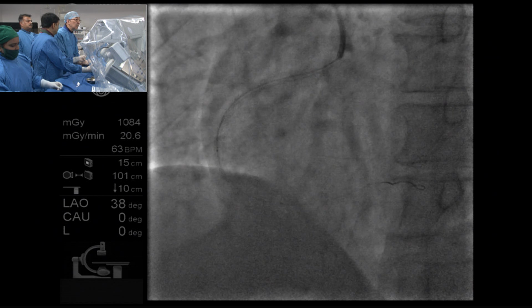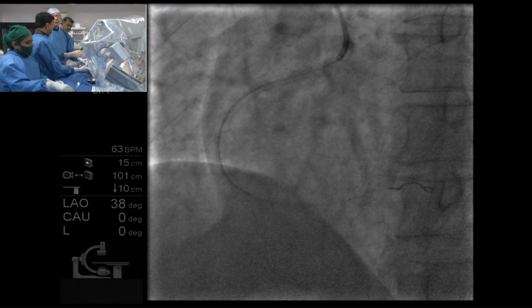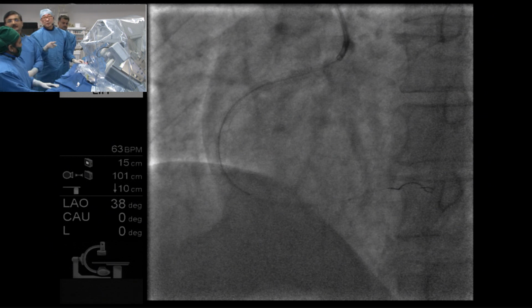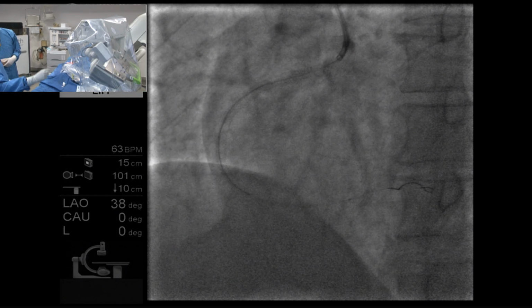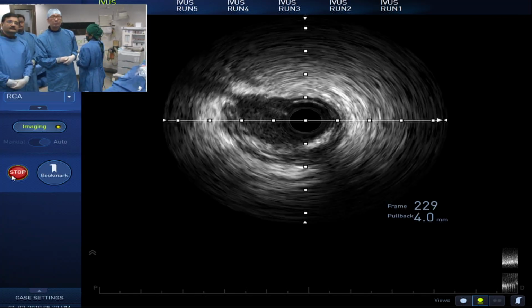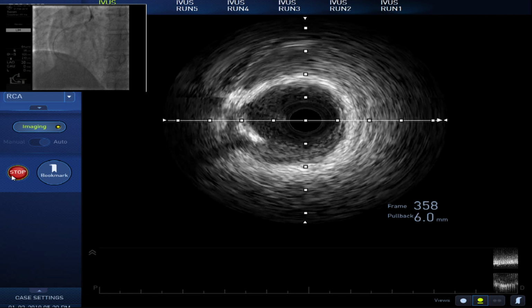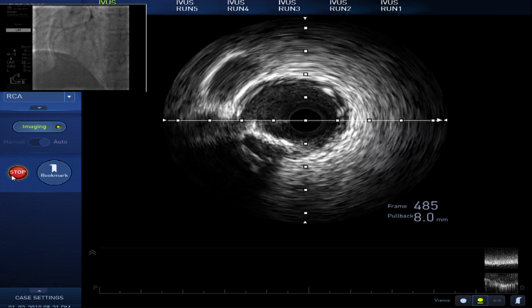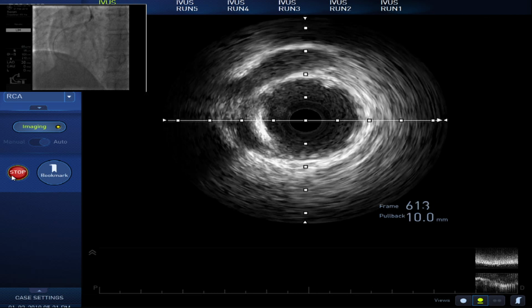Let's go, let's run live. Yeah, very good. It's distal to the stent. Somebody is watching the ACT. How much is the ACT? Anybody? ACT generally we do at the end of the procedure. They give 10,000 units, right? Most of the time it is above 300. We had a long procedure.